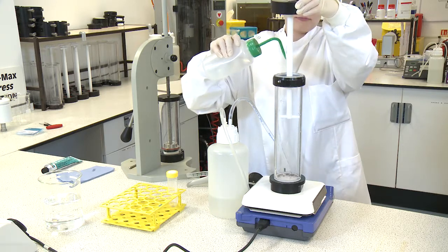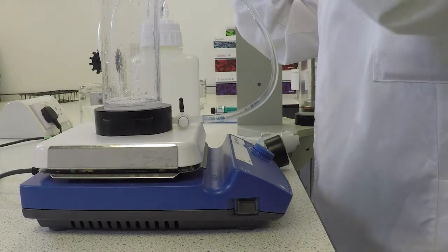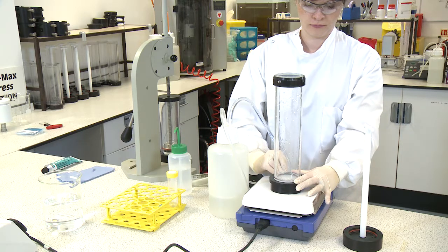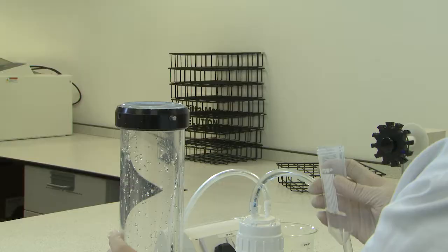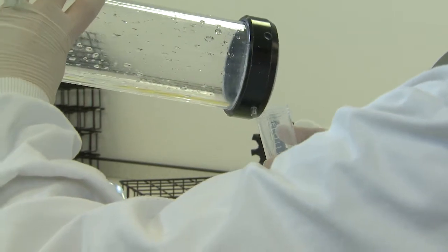Remove the magnetic stirrer bar and rinse the magnetic stirrer bar with PBST to recover any target organisms that may be present. Pour the remaining eluate into a 50 milliliter centrifuge tube.